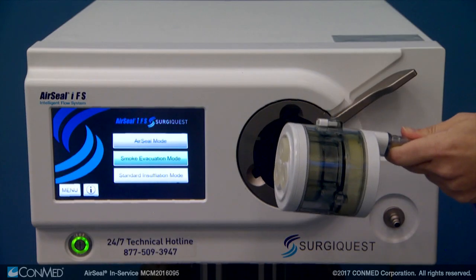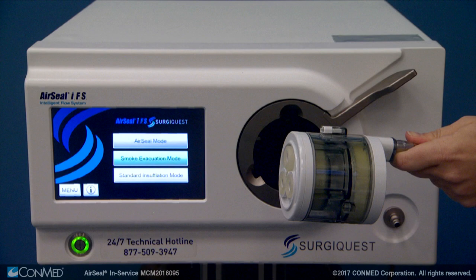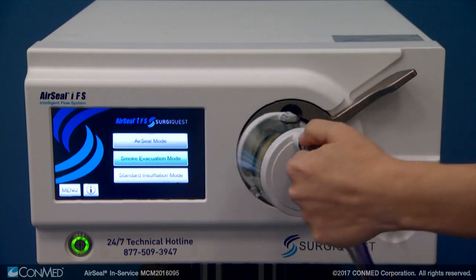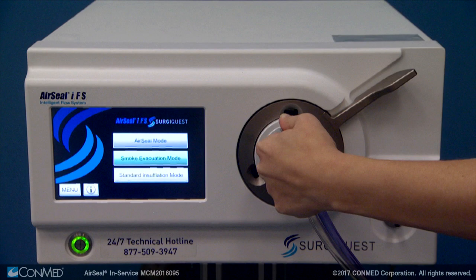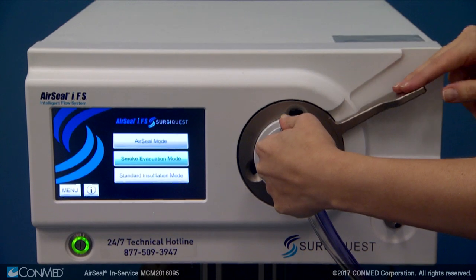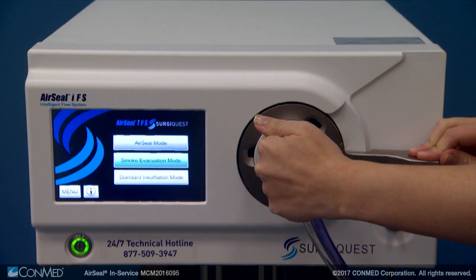Completely insert the bifurcated smoke evacuation filter into the IFS unit by holding the dual lumen tubing where it's connected to the filter, oriented upright at the 12 o'clock or top position. Then push the locking lever down until it stops.